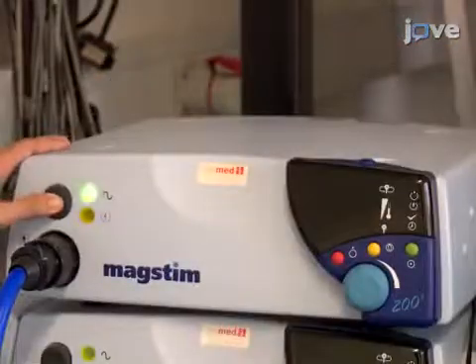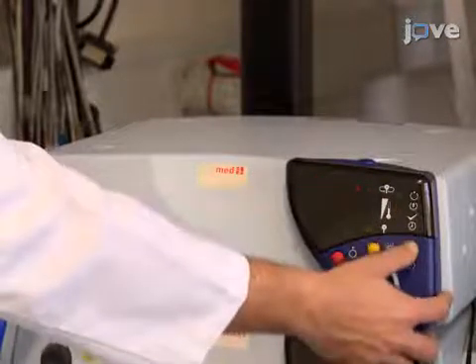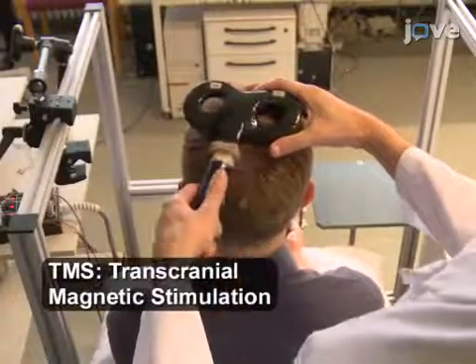Then turn on the magnetic stimulator and charge the capacitor by pressing the corresponding charge button. Place a figure-of-8 TMS coil on the participant's scalp on the motor cortex region. Hold the TMS coil in position.